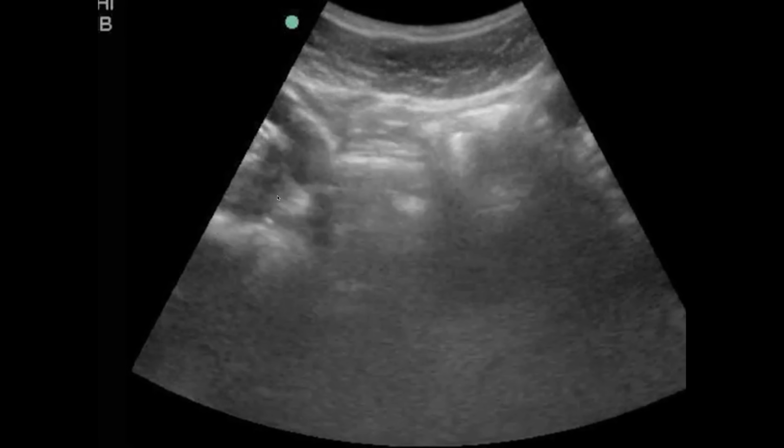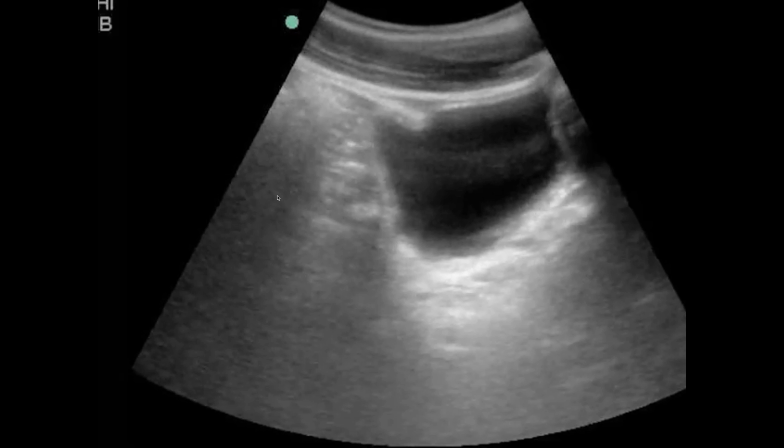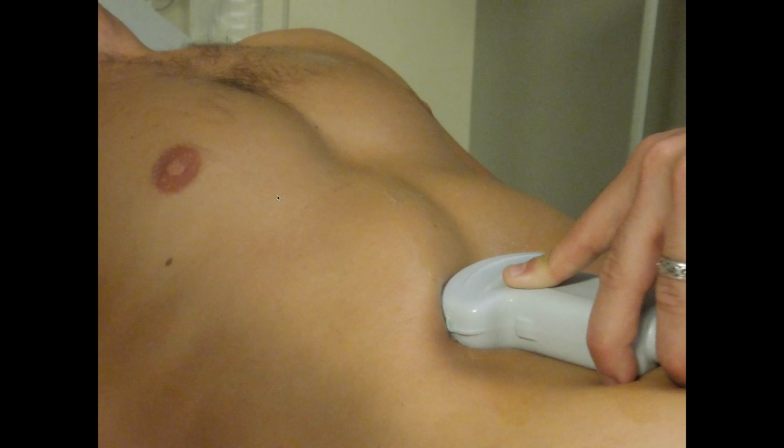Here's some movement through. I don't see anything there. Transverse, you actually fanned, looks like pretty well all the way through. I'm not trying to scare you with those, but that was looking normal.